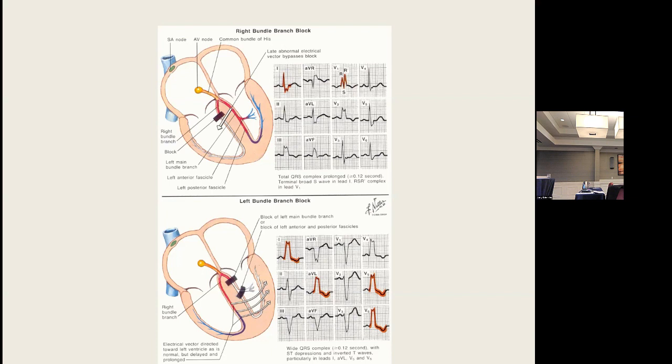It could be. But what this really is, is left bundle branch block with associated repolarization abnormality, cannot rule out lateral ischemia. In the case of a right bundle branch block, I get a peaking of R waves, late forces anteriorly, and negative forces laterally. 1, AVL, V5, V6, negative forces. The left ventricle has already depolarized, so the force looks like force away from those leads. And so you can really differentiate the 2 bundle branch blocks simply by looking at where the forces peak.